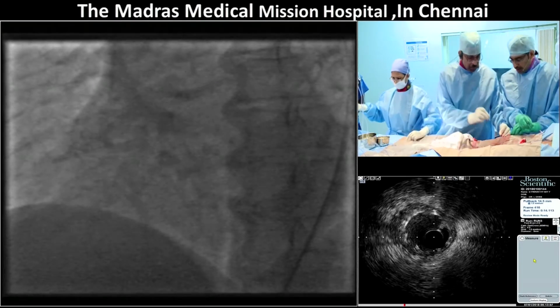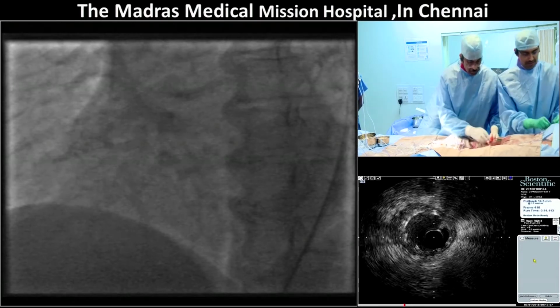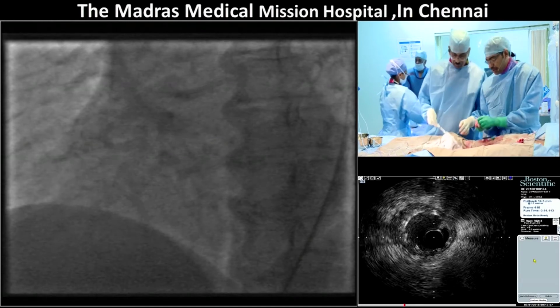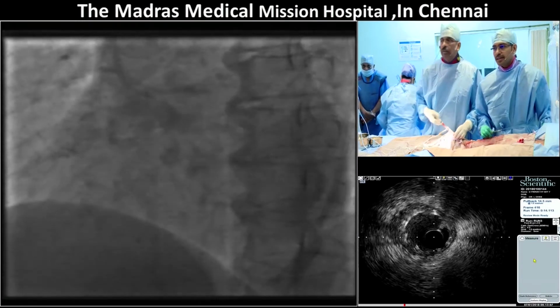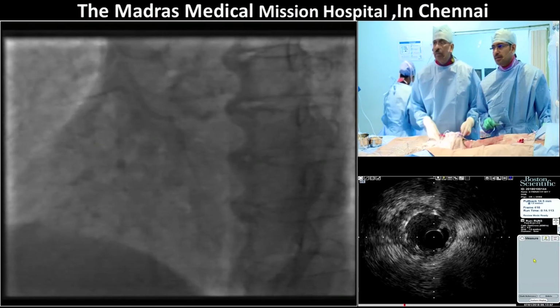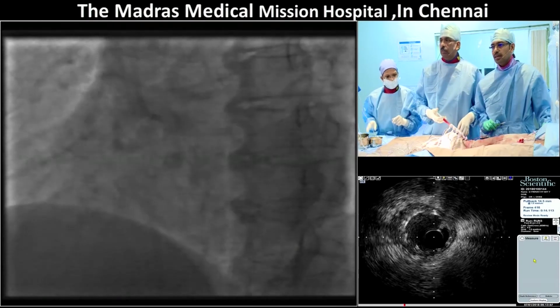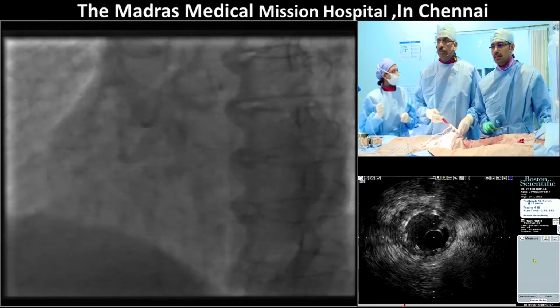Okay, so we'll just get through with the shots and then go ahead. Give a picture, then we can discuss the strategy. Then we can go to Dr. Shivakumar and come back here. Okay, so we're going to take some shots now. Diagnostic. So get the pressures, sister. Both pressures on, please. Okay, and please tell us the ACT, sister, when it comes.